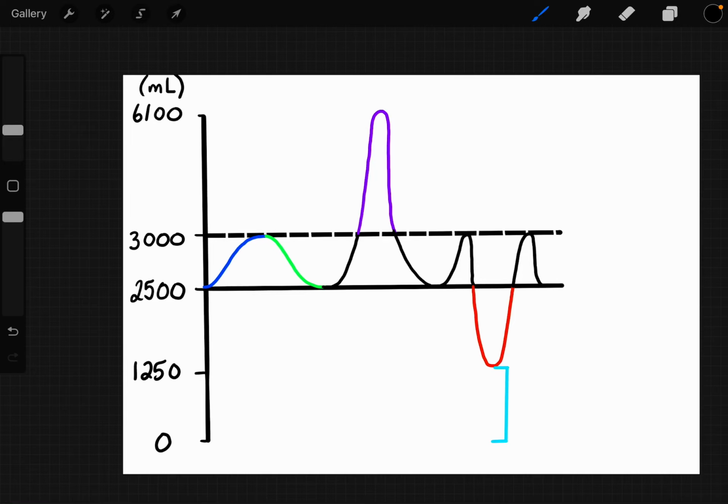Okay, so we're going to look at the graph that we discussed in class about the lung capacity, lung volume. This is essentially what they use as one of the diagnostic tools when you have patients with respiratory issues, like asthma, COPD, cystic fibrosis, anything respiratory related, when they're looking specifically at how much air can you take in, how much air can you exhale, what does a normal breathing look like in terms of how much air you're bringing in, et cetera.